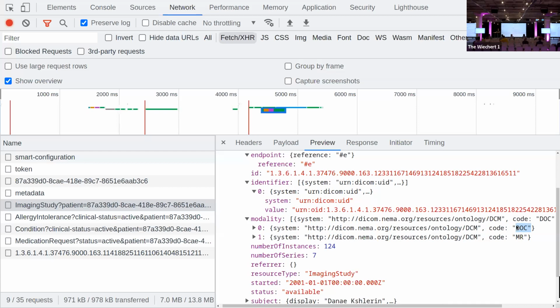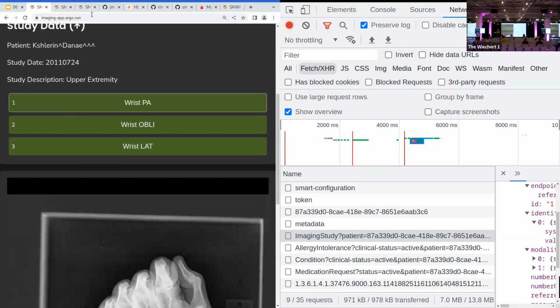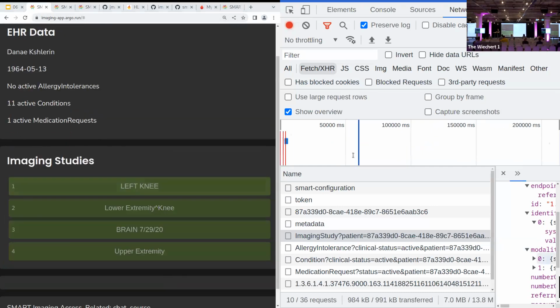It's kind of a funny example, but this is a pretty common thing: to just take a snapshot, a picture of a note, and include that alongside the other images. It's sort of like if you have a hammer, everything looks like a nail. So if you're sending along DICOM studies with MR imaging data, why not throw a note in as well? I didn't show that in the demo earlier. Let me hit the load button and see if I can actually get that to come up.